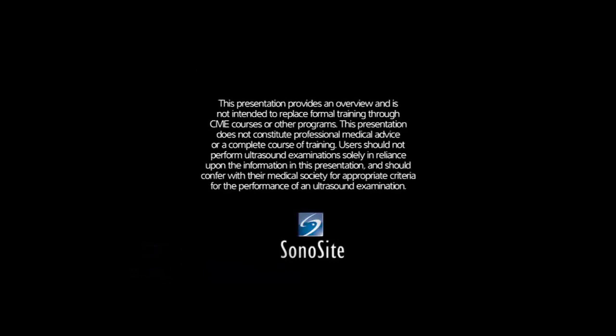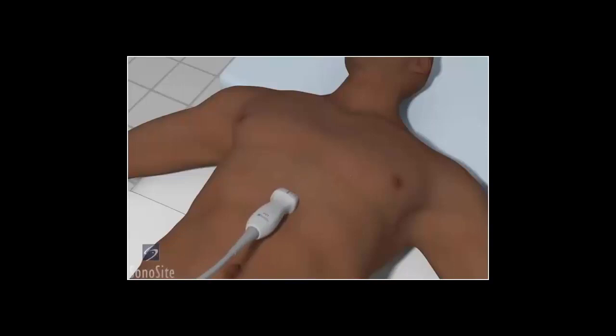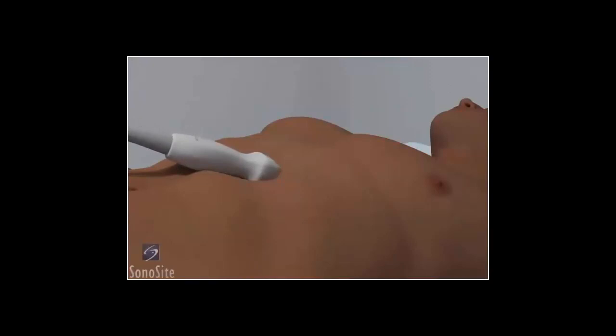A phased array transducer with an abdomen exam type is used to perform the subxiphoid or subcostal view of the heart in the FAST exam. Place the transducer in the subxiphoid position with the orientation marker to the patient's right side at a nine o'clock position. This view uses the liver as an acoustic window to visualize the four chambers of the heart. Aim the transducer slightly toward the left shoulder at a 15-degree angle to the chest wall. In some cases the transducer is almost flat to the abdominal wall so the ultrasound beam is directed toward the left chest cavity. A considerable amount of ultrasound gel and downward pressure may be needed to maintain contact.